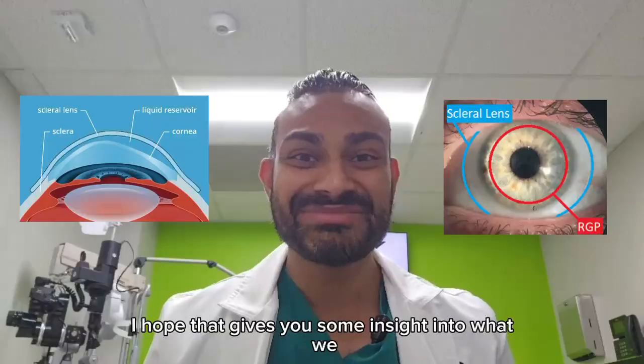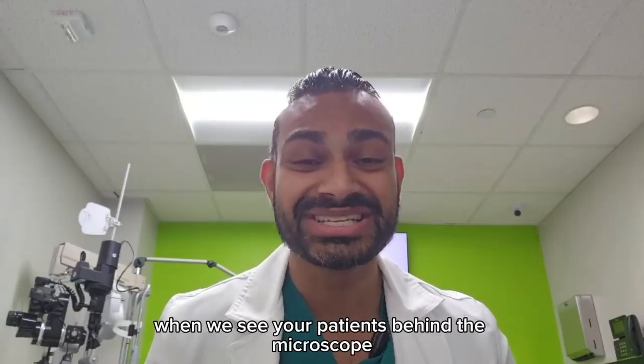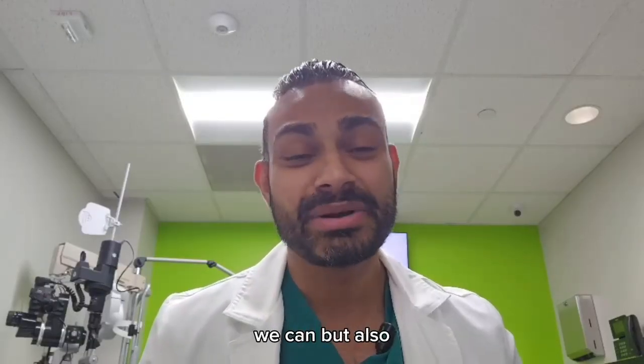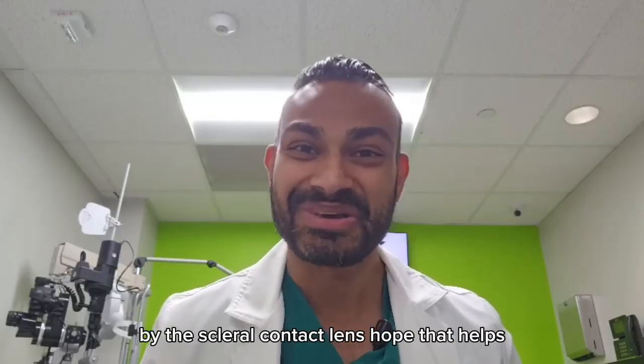So I hope that gives you some insight into what we as scleral lens doctors are looking at when we see our patients behind the microscope. So I want to make sure we, one, prioritize vision to make sure that we get the best visual outcome we can, but also that the ocular surface is not being impacted by the scleral contact lens. I hope that helps.